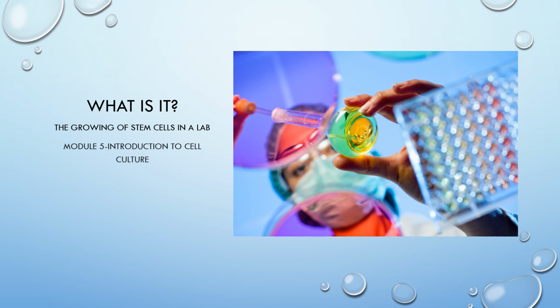Stem cells can proliferate in laboratory environments in a culture dish that contains a nutrient broth known as culture medium. And most stem cells attach, divide, and spread over the surface of the dish. The culture dish becomes crowded as the cells divide, so then they are going to need to be replated in the process of subculturing, which is repeated periodically many times over many months. And each of the cycles of subculturing is referred to as a passage. And then these cells can be transformed into a variety of terminally differentiated adult cell types, which can then be used for disease modeling or toxicity testing.